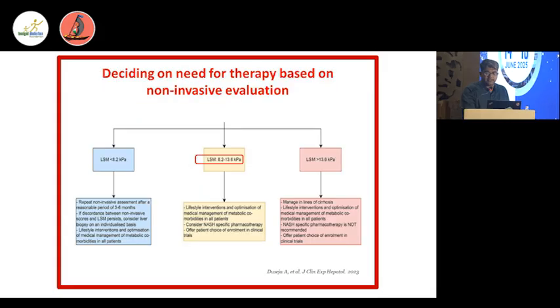The higher the stiffness, the higher the colors will be on the color bar. By using this, we can distinguish between the various stages of fibrosis. As you see, the higher stages of fibrosis with higher values in FibroScan show up differently in elastography than for a normal liver. You can have a lot more red here, which means that in these areas the liver is much more stiff as found out in the elastography.